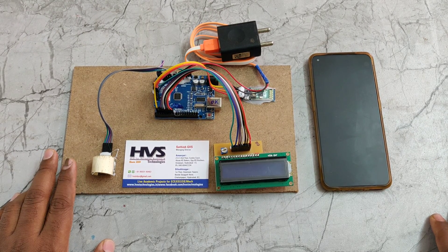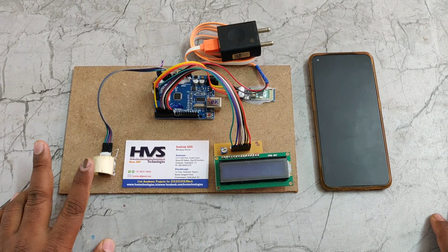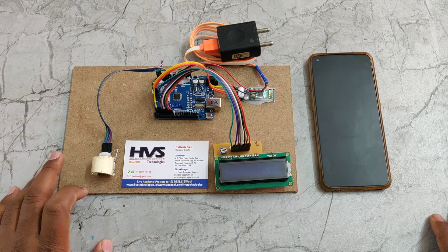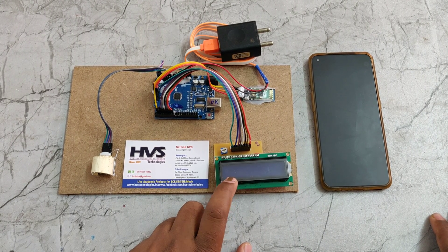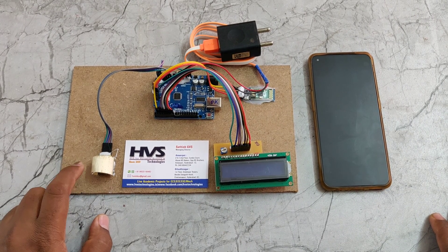Based on the received signal, we estimate the blood density, and from the blood density the glucose levels are calculated by the Arduino board and displayed on the LCD screen. The 16x2 LCD screen is interfaced at pin number 2 through 7, and the sensor is interfaced at A4 and A5.